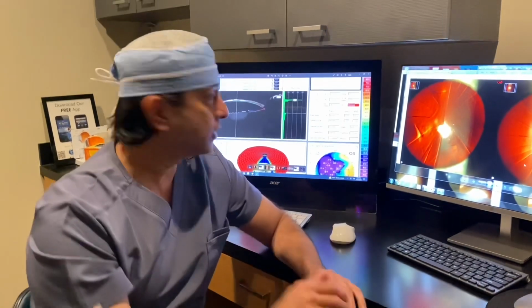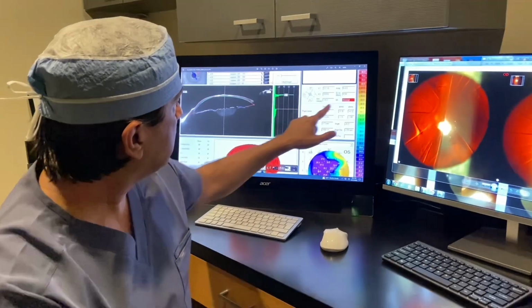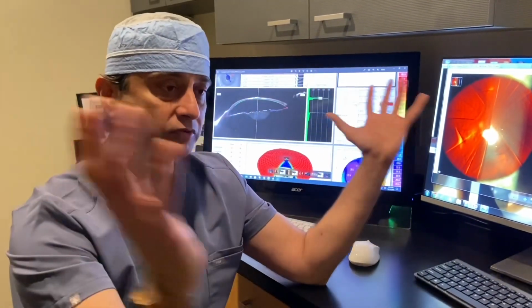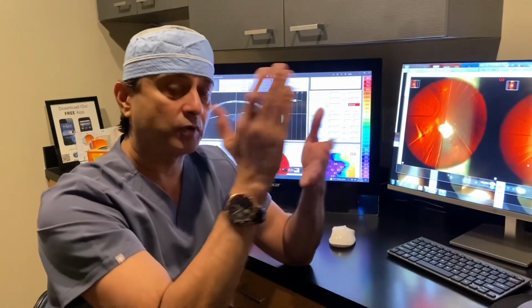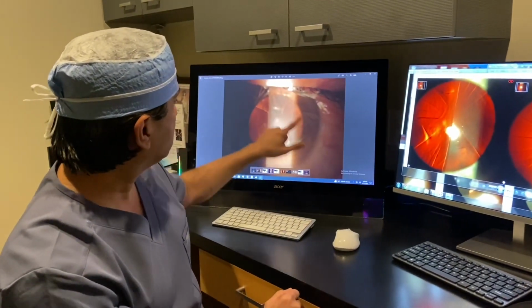No keratometry, nothing. And we have to go over here, look at this keratometry, measurements, axial length, all the different technologies I carry, eye trace and all these things. Sit down tonight and start planning and thinking and use over 3 decades of experience to decide what lens, what optics to use. So that's this case over here. You can see these patients, how the cornea looks broken.